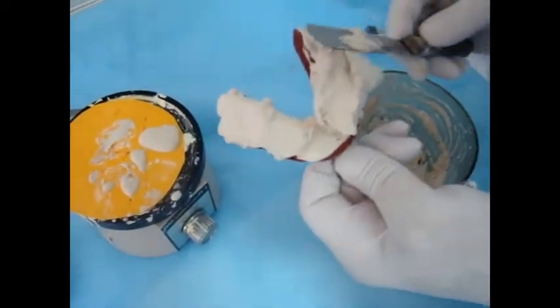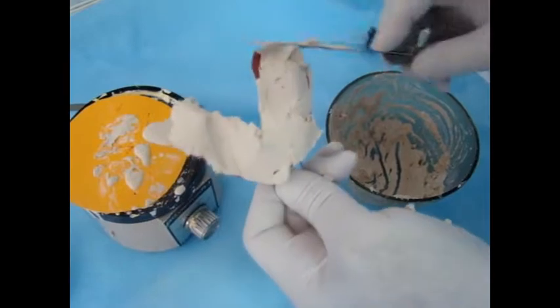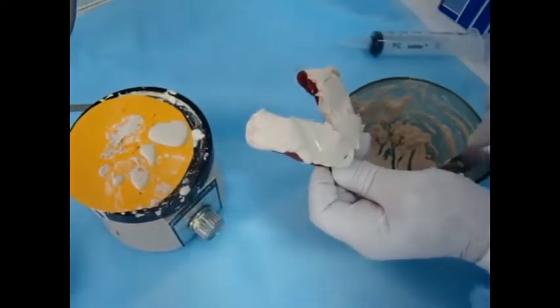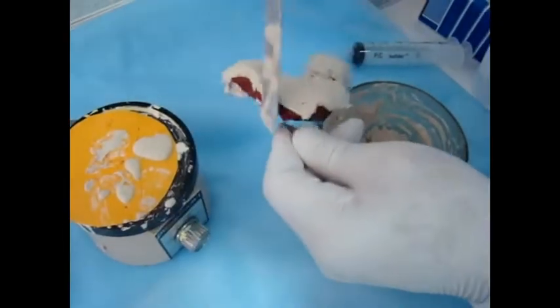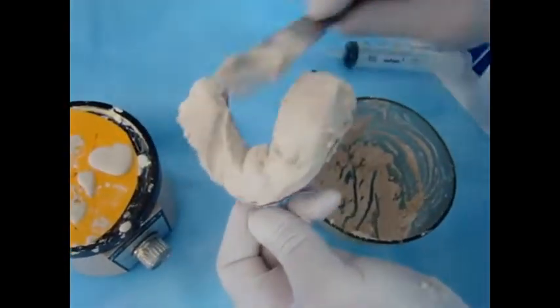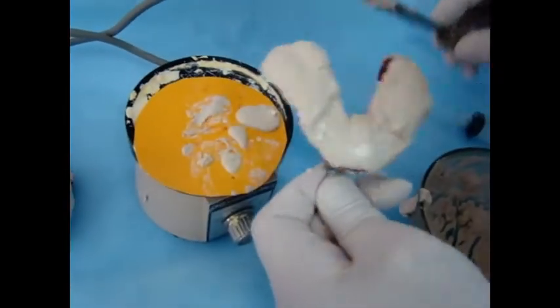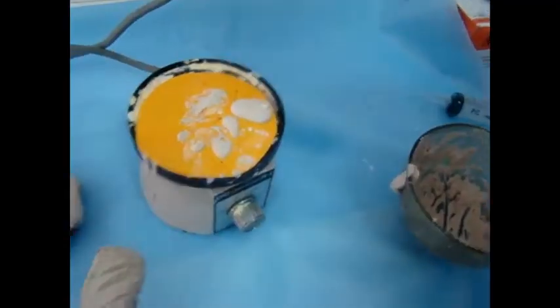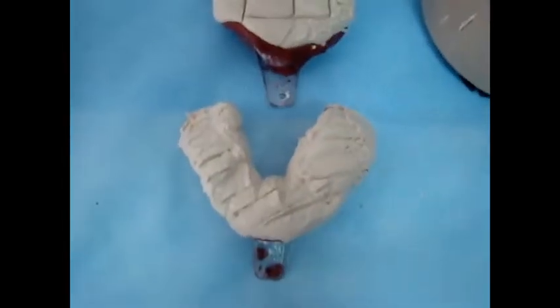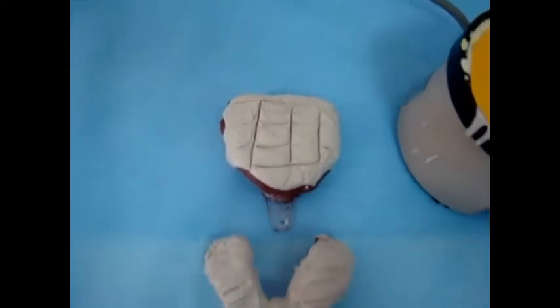Now the second pour is added. Make sure that the borders or the flanges of the impression are covered with the plaster of Paris. A little bit of vibration and the retention grooves are made.